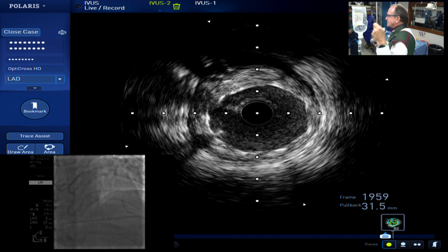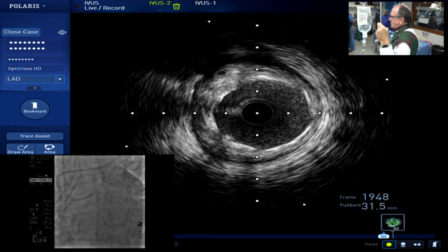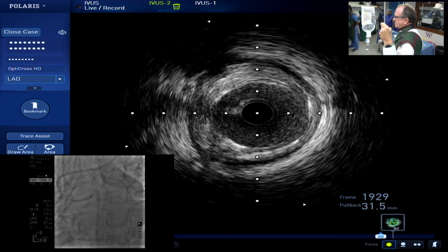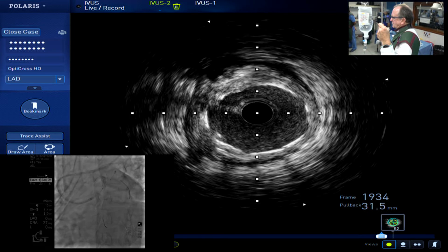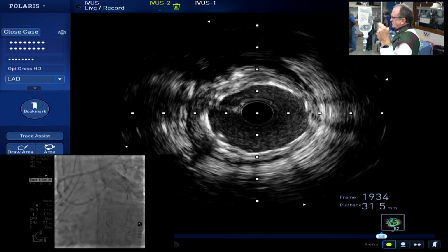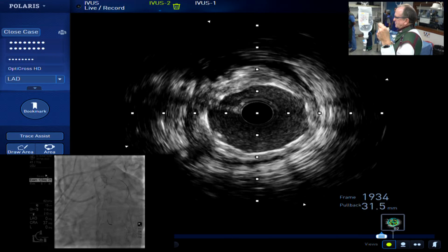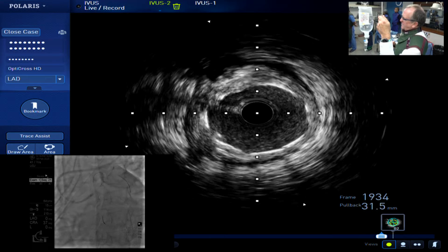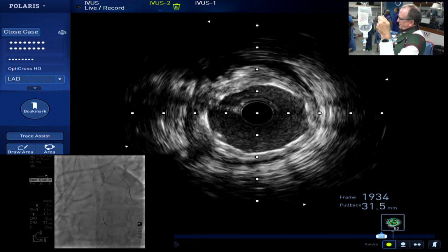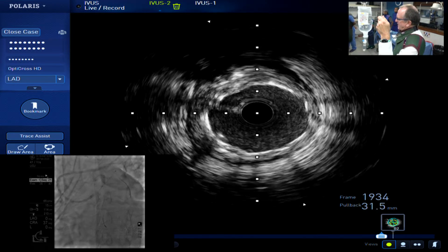If in the diagonal we take a slightly bigger balloon and overlap that balloon with this LAD, and both balloons are inflated simultaneously, there won't be any plaque shift. I think the debate can be on that also. If this diagonal balloon is also slightly bigger, or you can pull it back and then inflate both balloons simultaneously, then plaque shift will not be there. Even if the wire has gone in the stent, it will make the wire-stent morphology conform according to the vessel.